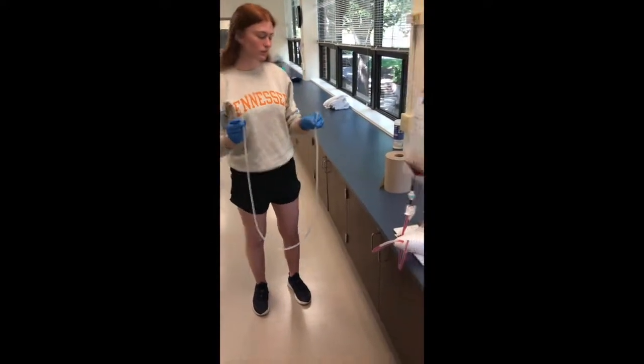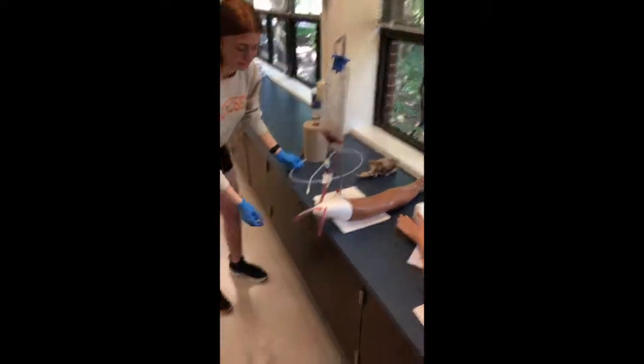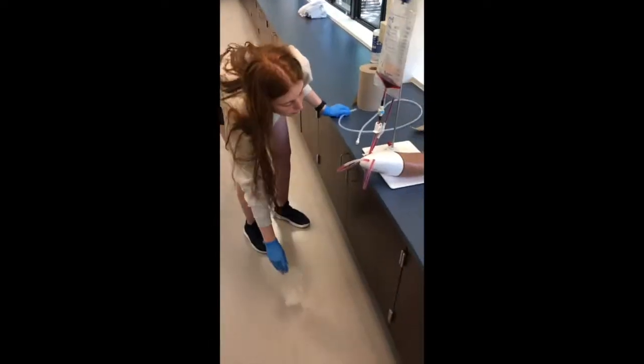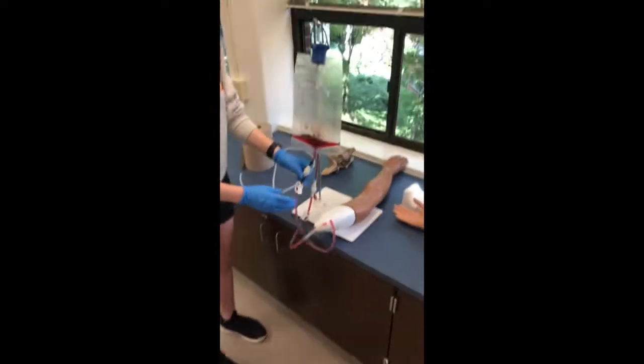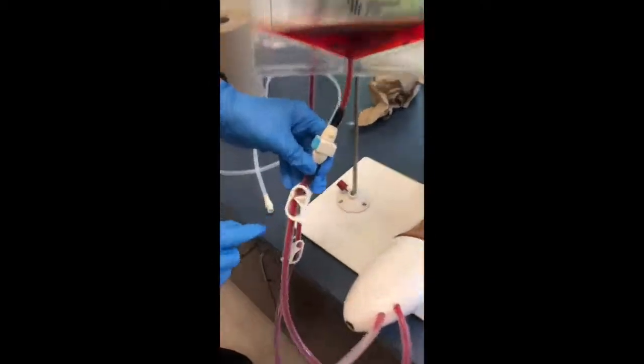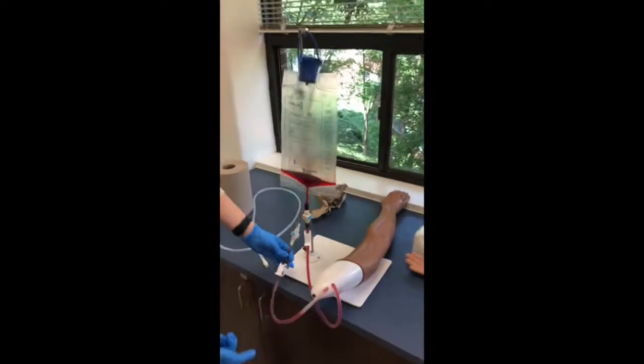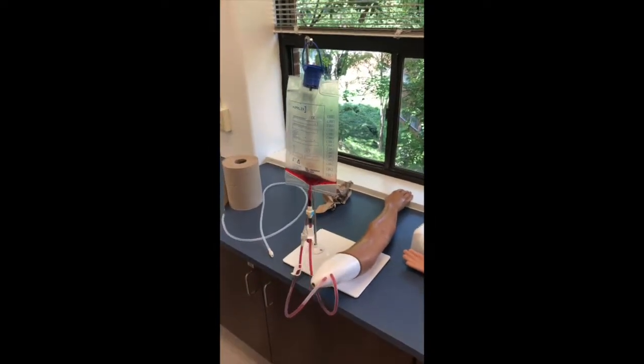This video will be about taking apart the IV arms and how to clean them and put them away. You'll need a canister to catch the blood that's draining out of the arms and an adapter tube to properly drain it. The first thing you'll need to do is make sure that the clamps are clamped — you do not want this pouring all over the floor because it will stain everything.